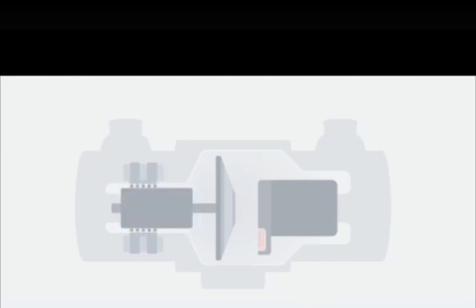And then the last part is the bearings that are in between the rotor and the rest of the X-ray tube. The bearings are low-friction spheres that allow for free rotation of the rotor. During the prep phase of an X-ray exposure, you can actually hear the sound of the rotor turning on these bearings. So that's an overview of the major components of an X-ray tube.